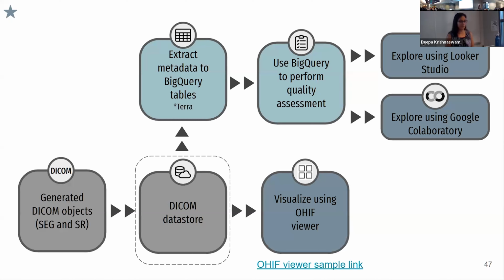So we really wanted to spend a lot of time trying to come up with different heuristics to understand our data. And then once we could filter out the data that was actually useful, then we could take these to a radiologist and say, okay, now we want to make sure that these are correct, maybe perform some population studies and compare against literature. So that was our overall goal.